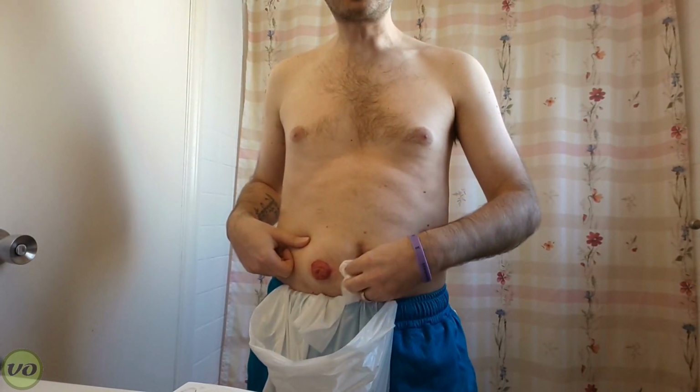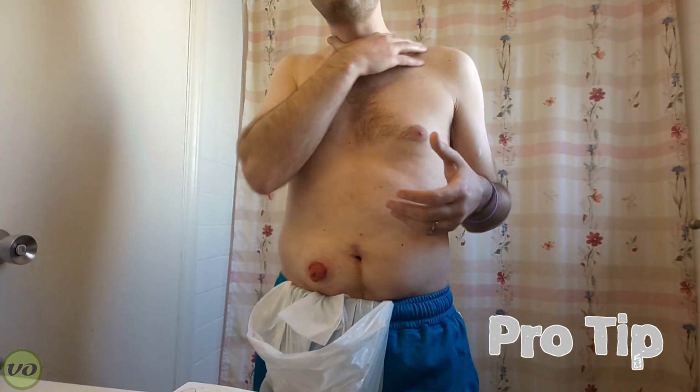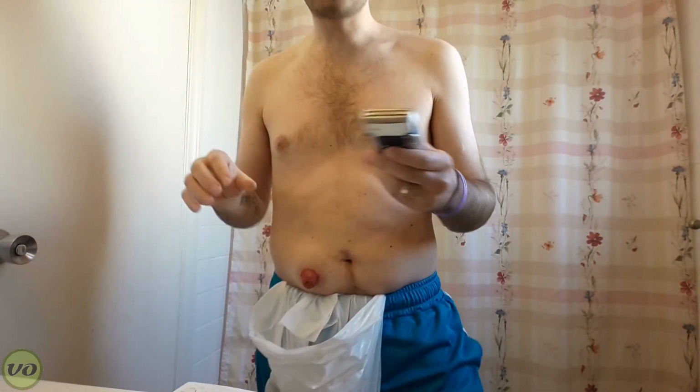Now, because I tend to have a fairly hairy stomach, I do shave it afterwards. It's best to use an electric shaver. A lot of the times, people who use just straight edge razors or the disposable razors, they tend to get ingrown hair, and when that happens under your wafer, it can be problematic, and you really want to avoid those kind of problems. So what I'll do is I'll just take my electric razor here.